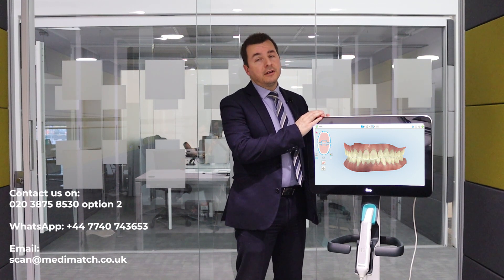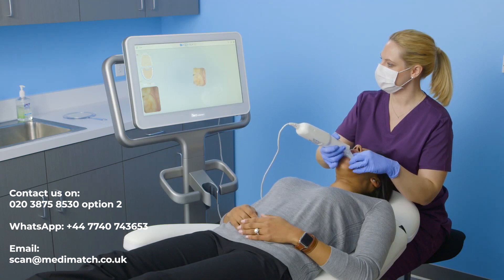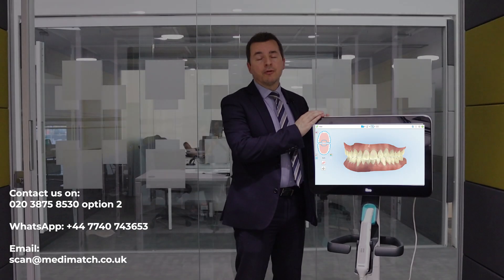iTero scanners are designed to fit into your practice and set up to send scans seamlessly to your dental laboratory. If you wish to add Many Match Dental Laboratory as your preferred laboratory partner, then we'd ask that you do the following.